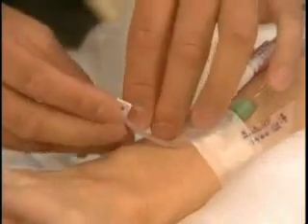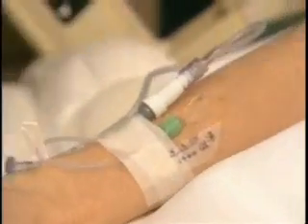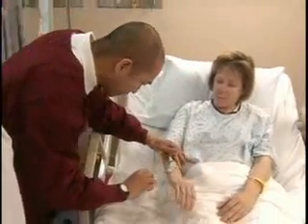All right, everything looks fine. Now I'll just clamp off the primary IV tubing, and I'll also clamp off the short extension tubing. Then remove the primary IV tubing from the access cap.